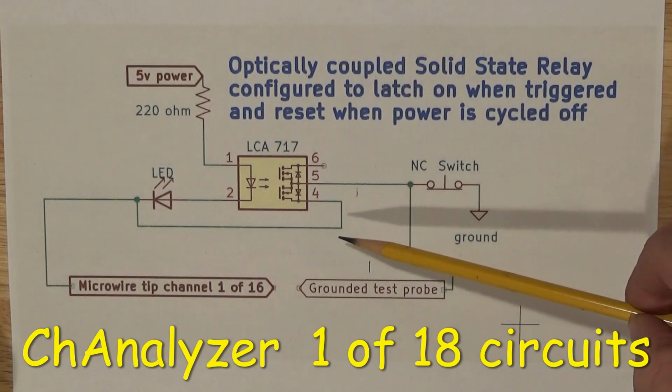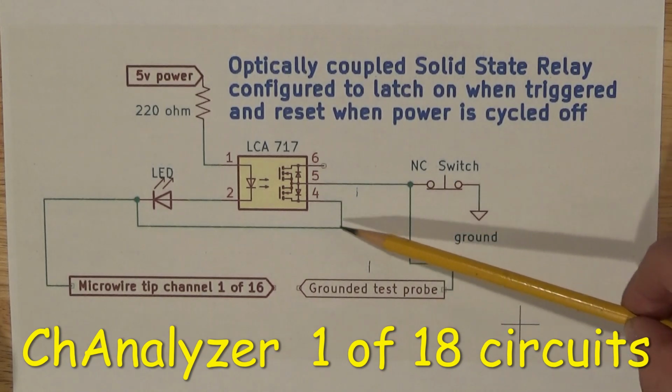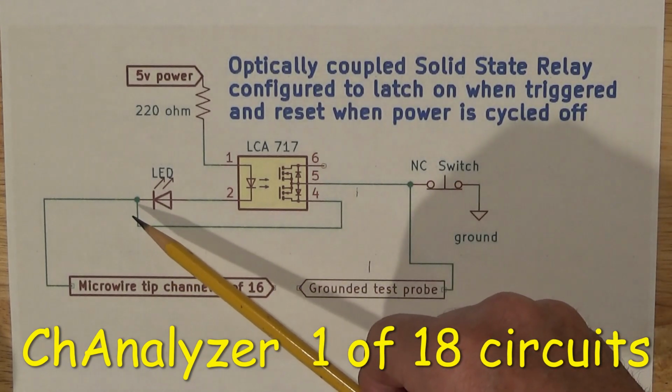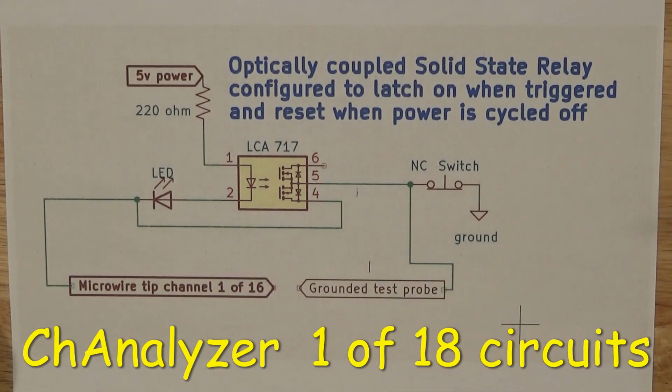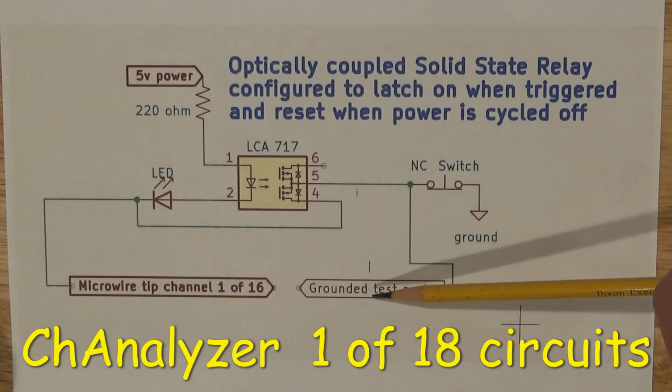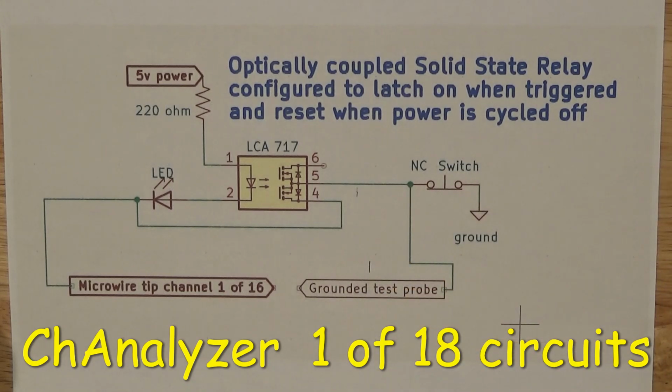And when that happens, it latches on. Pin 4 then applies a constant ground to the same circuit that you applied the momentary ground, and that keeps it latched until you remove power. And this switch here, the normally closed switch, which is on the test probe, is what you use to disconnect and unlatch the device and reset it for the next channel.